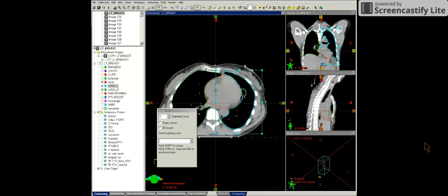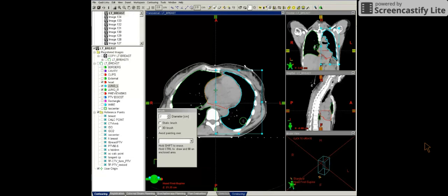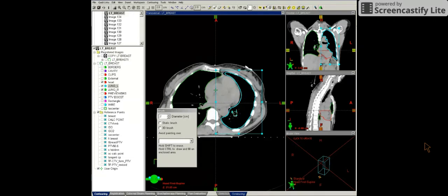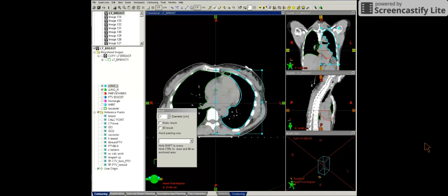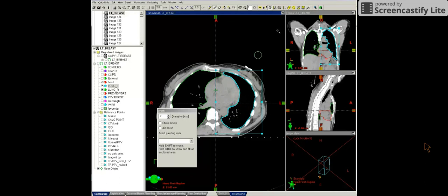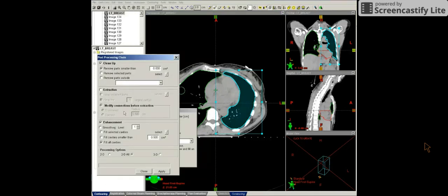But the segmentation wizard gets you fairly close. And if you go outside the line, just hold down the shift key. You can erase.